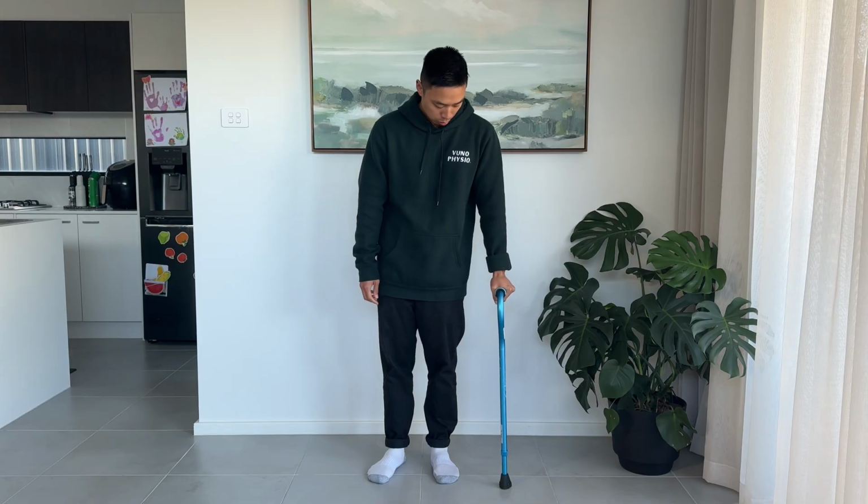As you go for a walk, just check how it feels. You can adjust the height one level up or one level down, depending on what feels more comfortable and safe at the time. Just make sure that it's not too high, that you have too much bend in your elbow. If there's too much bend, you can't use your full arm to support yourself when you walk. This becomes important in case of an emergency where you do have to put it down quickly. And also just make sure it's not too low that you're having to reach down for the ground.